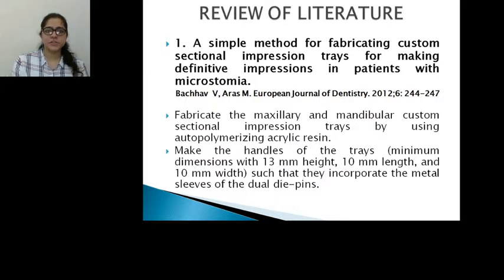Coming to the review of literature, firstly, a simple method for fabricating custom sectional trays for making definitive impressions in patients with microstomia. They fabricated the maxillary and mandibular sectional trays using autopolymerizing acrylic resin. They made handles larger than the normal trays. The minimum dimensions of the handles were 13 mm in height, 10 mm in length, and 10 mm in width. The larger handles were made to incorporate metal sleeves of the die pins.